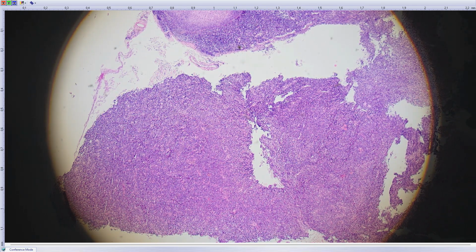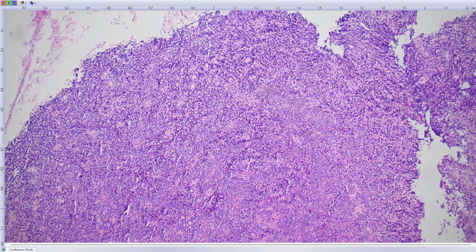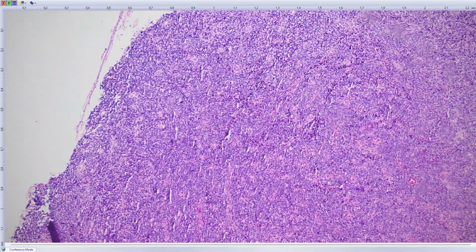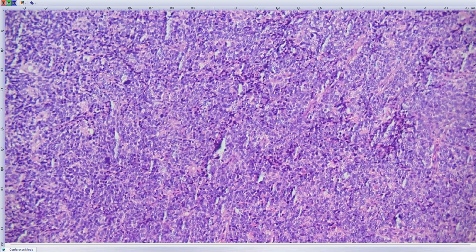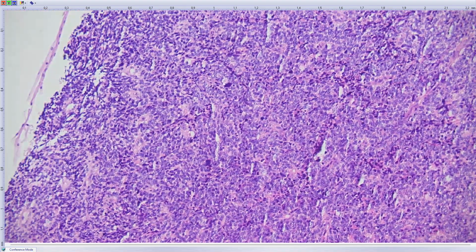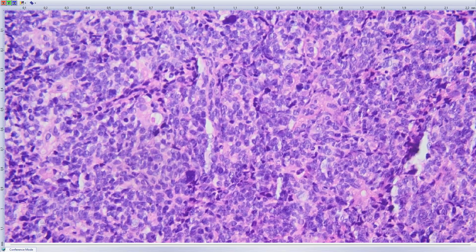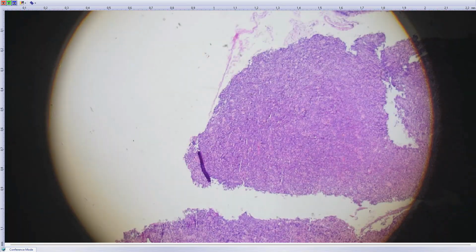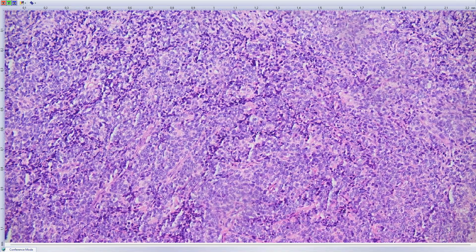The lady had big cystic lymph nodes on the neck, and we diagnosed metastatic HPV-positive squamous cell carcinoma. If you look at very high magnification on this tonsil, you can see this tumorous infiltration of non-keratinizing squamous cell carcinoma. So if you only use very low magnification, you can easily miss it. You can think it's only lymphoid tissue there, but it's not.